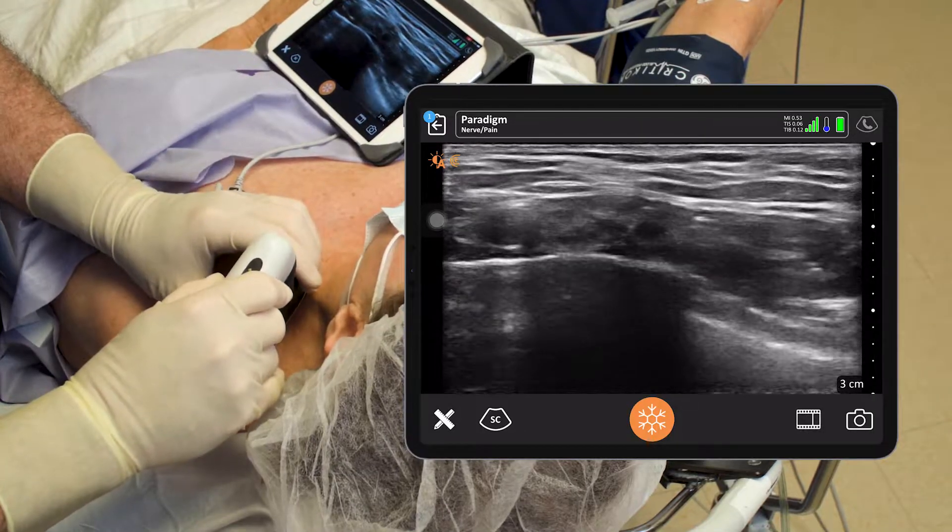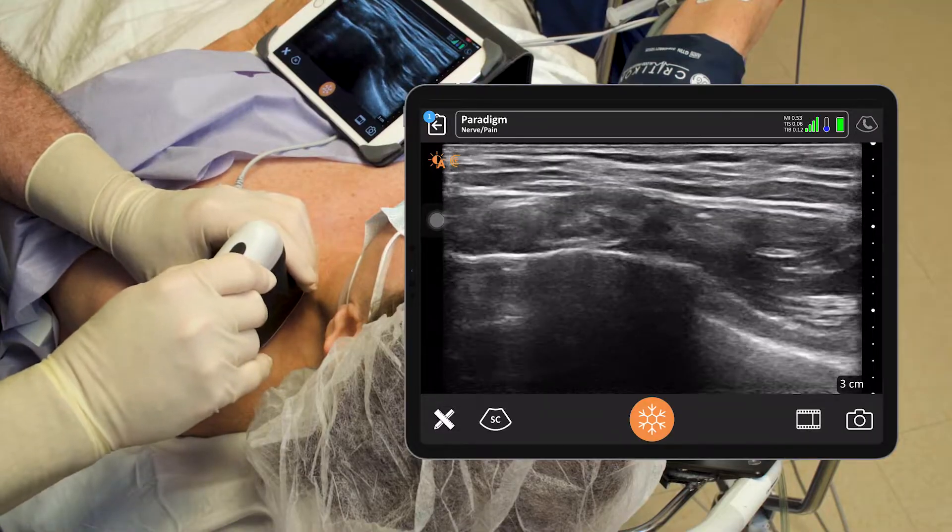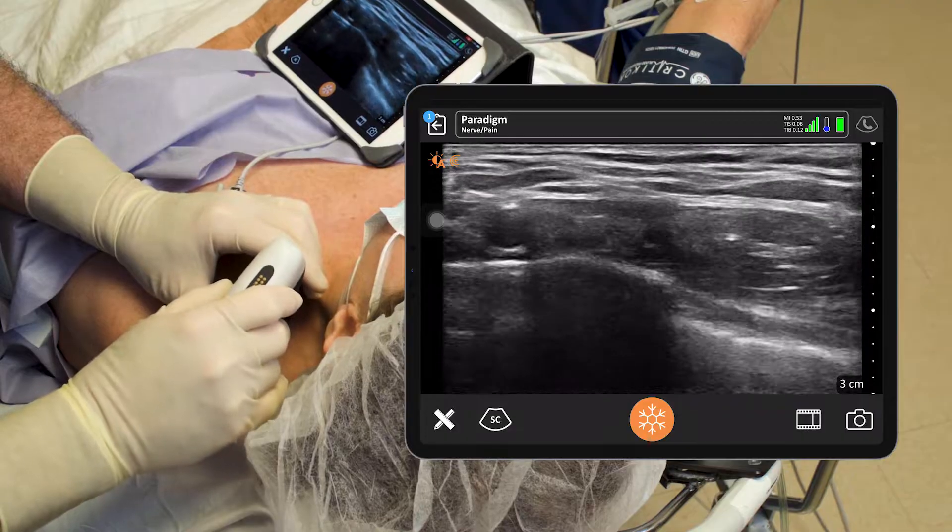It's really easy — just slide a little bit to the right on the screen of the iPad to increase the gain.